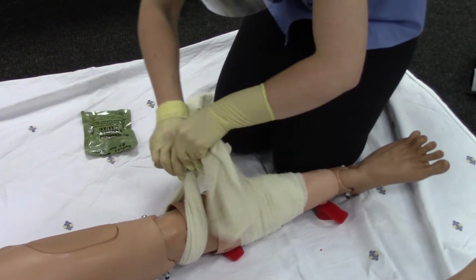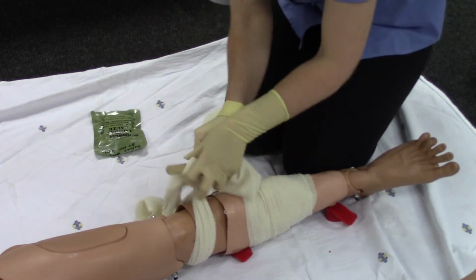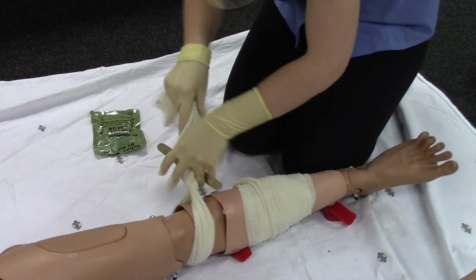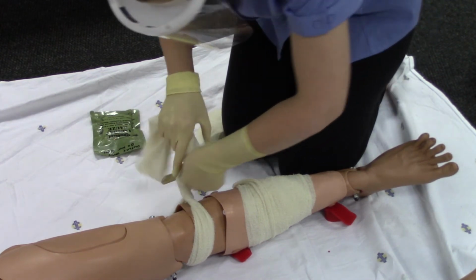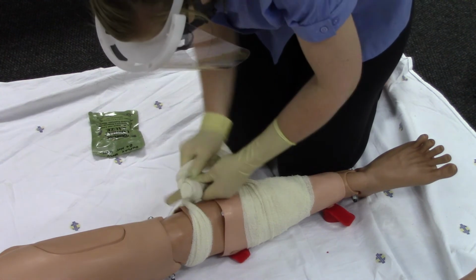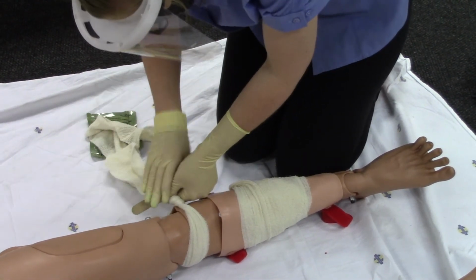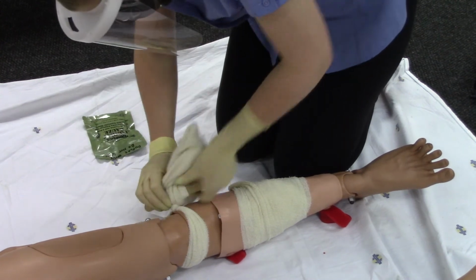Turn the stick to tighten the tourniquet. Continue tightening until the bleeding stops. Secure the stick with the remaining bandage.